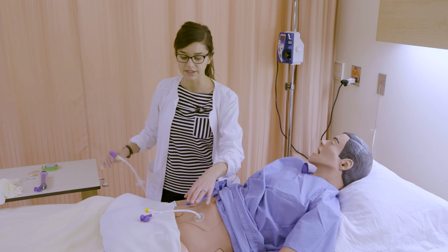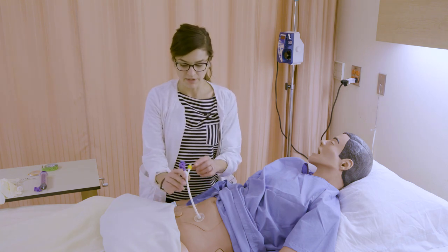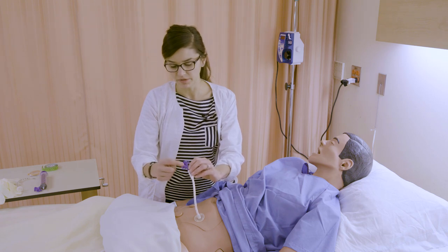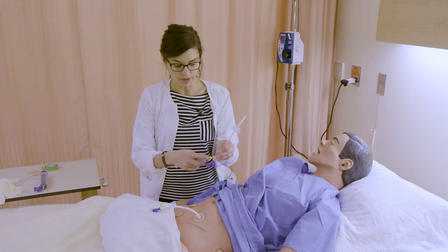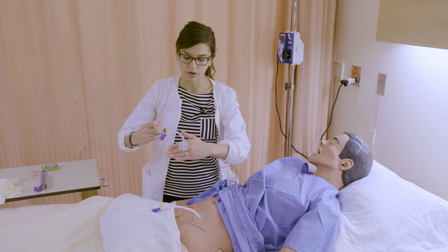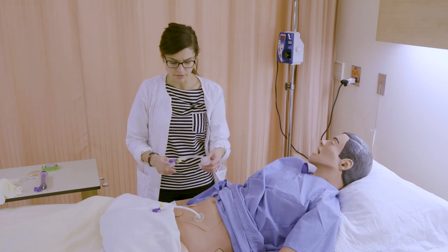Probably the most common type you'll see is this type we have right now in Jake. This is a balloon gastrostomy tube, sometimes called a G-tube or GT tube, which just stands for gastrostomy tube. It has a bolster at the bottom, markings along the side, and ports for feeding and medications. It also has a balloon port with a yellow cap. There is a balloon inflated with sterile water inside the person's stomach that helps hold the stomach up against the abdominal wall so that feeding goes directly into the stomach through a hole at the bottom of the tube.